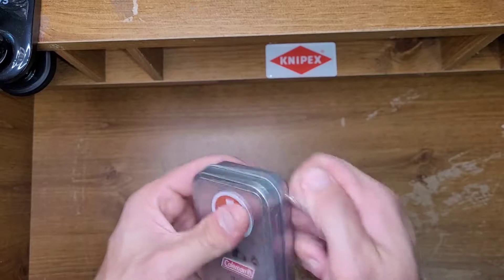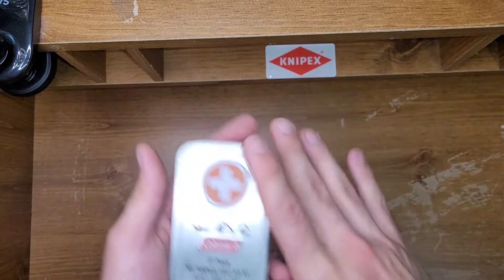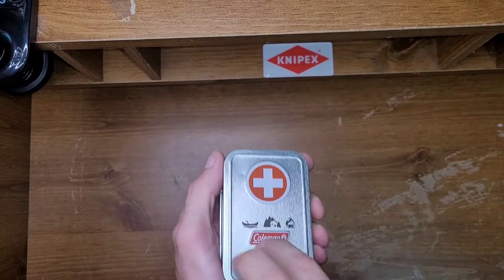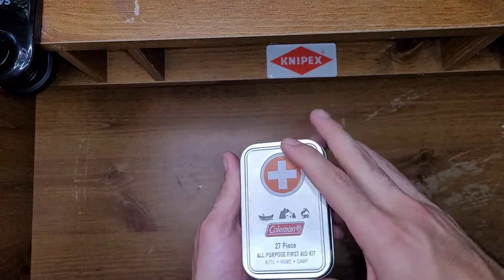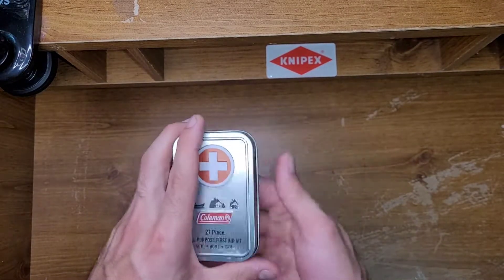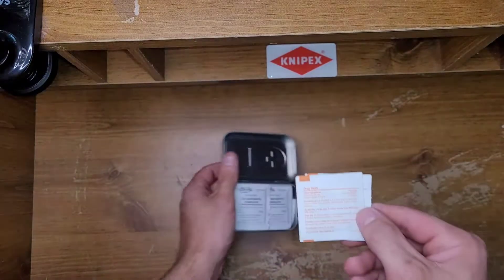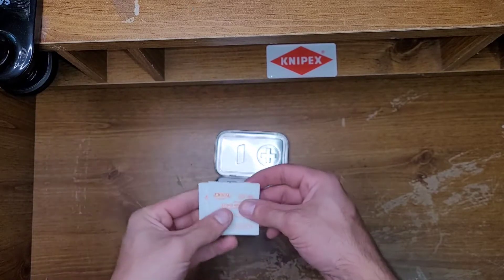It tells you on the back exactly what's in it, but I don't like looking at that — I'd rather open the kit. The reason I bought this is that tiny pocket first-aid kits are handy. As some of you who've been watching the channel have seen, I keep the Adventure Medical Kits first aid kit in my bag, and I've been looking for something smaller for my tool bag. I'm just kind of interested in what kind of items mini first-aid kits keep in them.